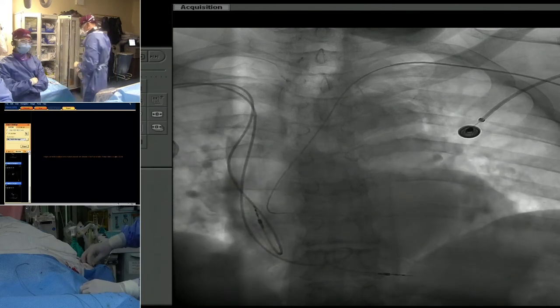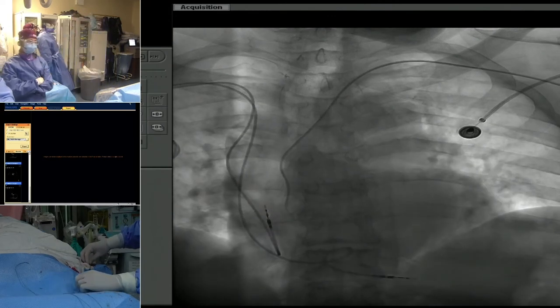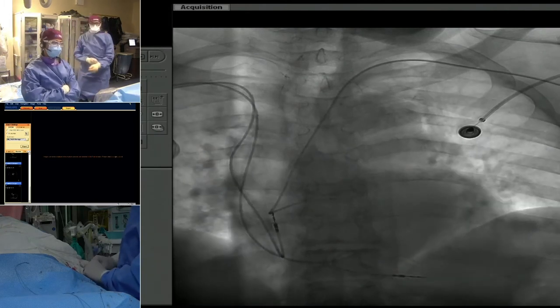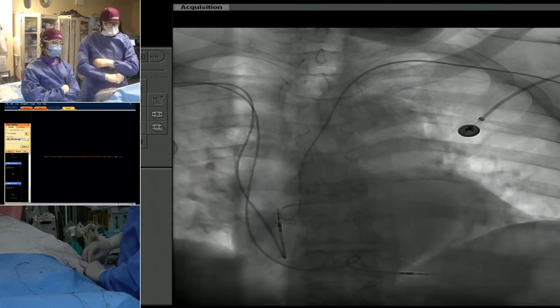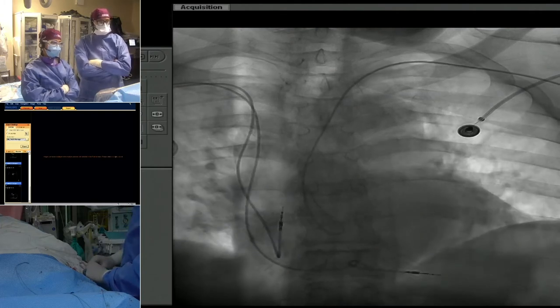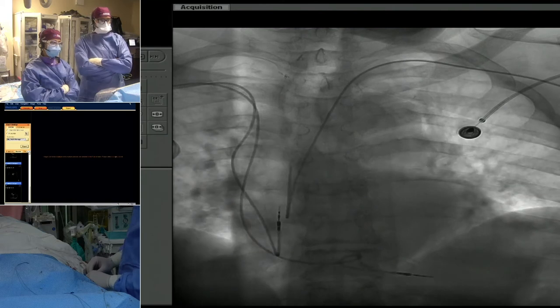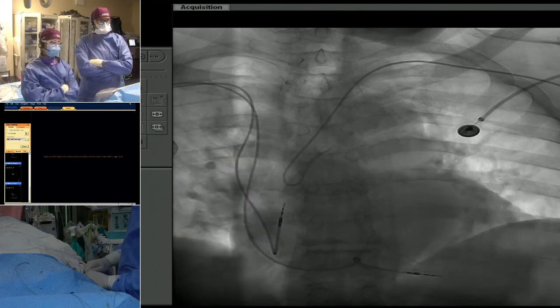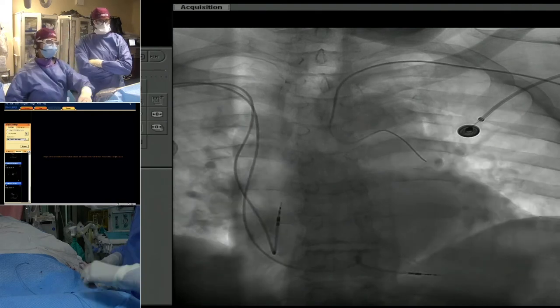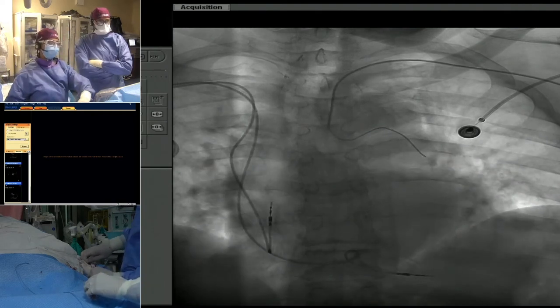And I'm going to push this down into the heart and form it down here. Then I'm going to spin the catheter over to the other side without the wire. And then I'm going to flip it back, push a little wire out as I bring this catheter back on the undersurface of the aorta. You see how we just did that? And then we send the wire down. Oh, we missed it. Let's try it one more time.